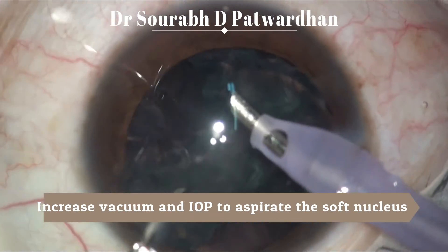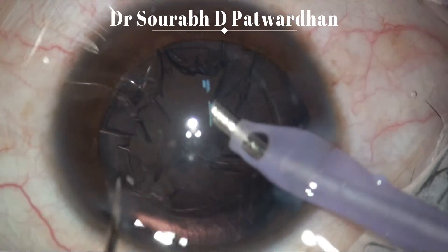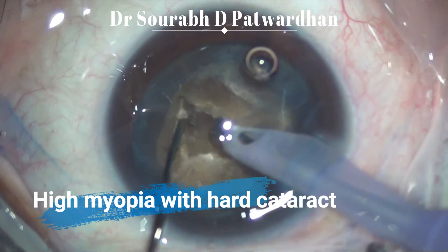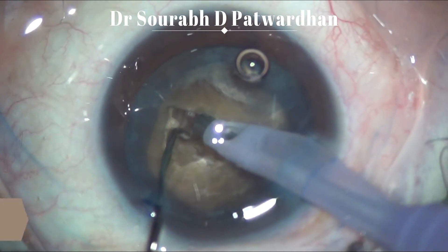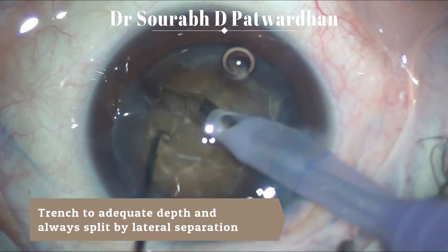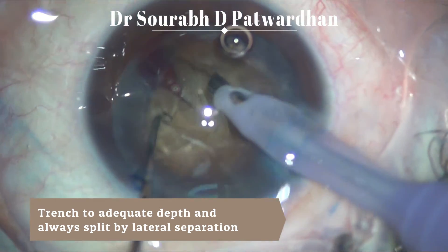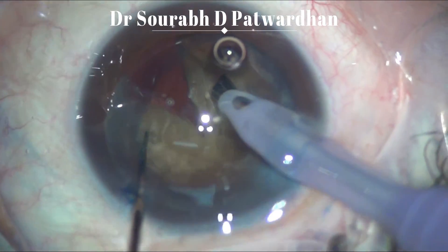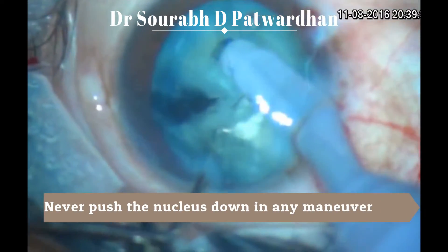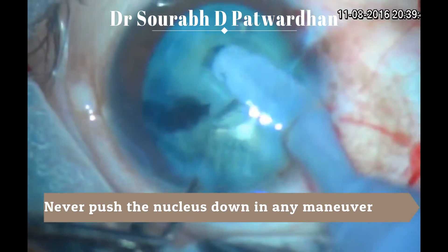It is important to only use aspiration and not use the phaco. In cases of high myopia with hard cataract, the most important thing is to do all the maneuvers with lateral splitting sideways. Avoid pushing the nucleus down, because due to low scleral rigidity there is a tendency to push the nucleus down, which leads to zonular dehiscence as well as posterior capsular rent.